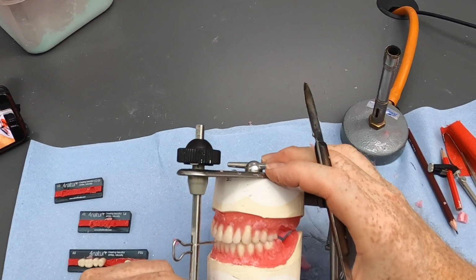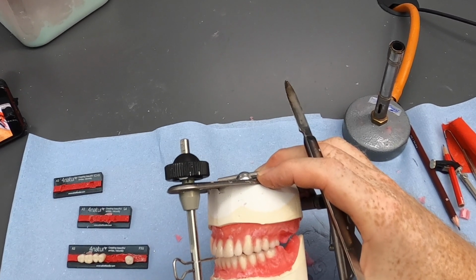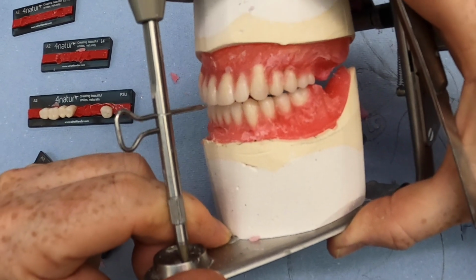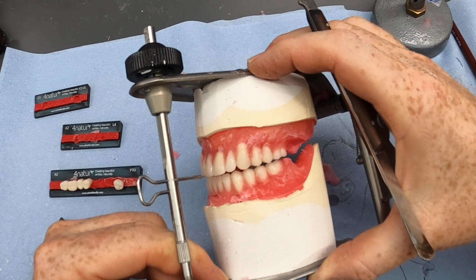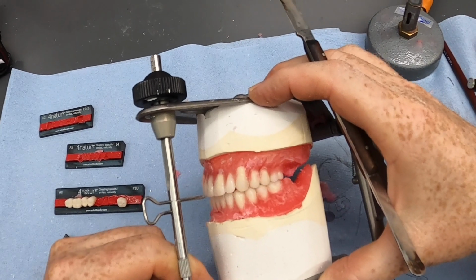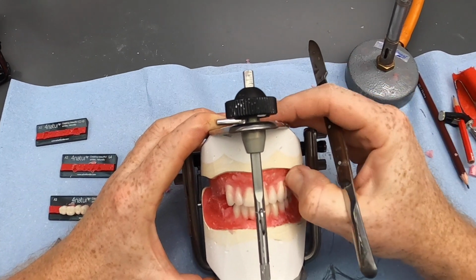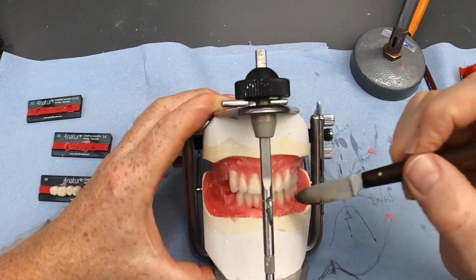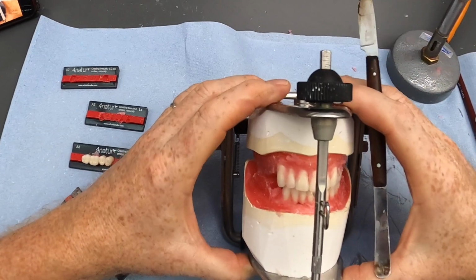Okay. And then when we go into our balancing side excursion, you can just see the palatal cusp of the upper 6 contacting the buccal cusp of the lower 6 there, hopefully. Let's try and move in a little bit closer. And that would be our balancing side contact. So the mandible's now moving away from the camera and we're going into the non-working side excursion. Okay, so I am going to let that wax cool down, give the teeth a final tweak into position, and I'm also going to set these teeth on the other side, and I'll talk to you once I've done that.